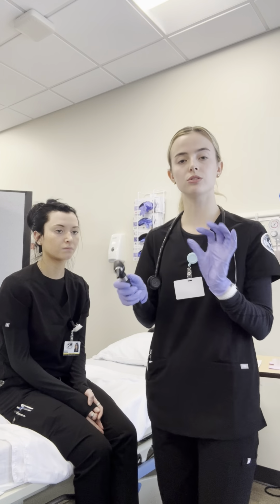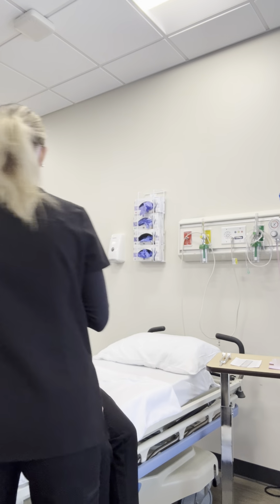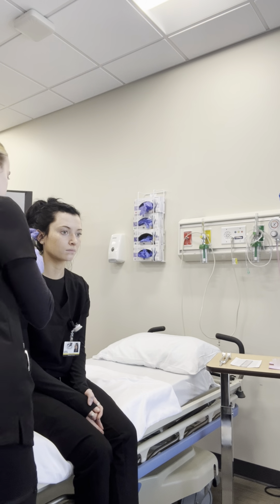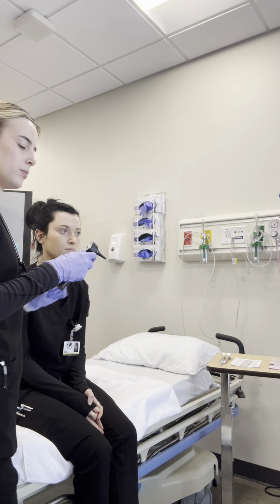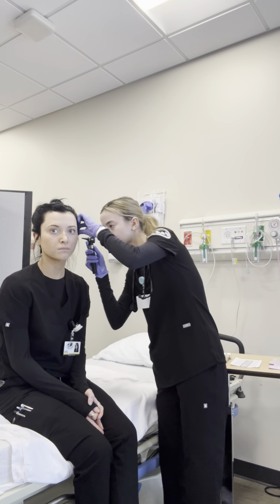And then I want to look further in the ear at the tympanic membrane. So to do this, I would lift the pinna of the ear up and back. And for this assessment, we're pretending to go all the way into the ear, and we do this bilaterally.